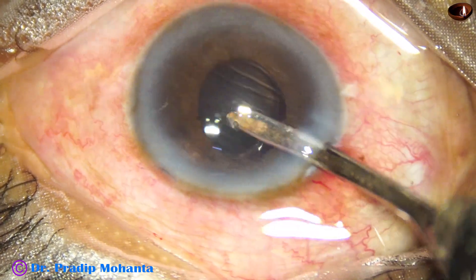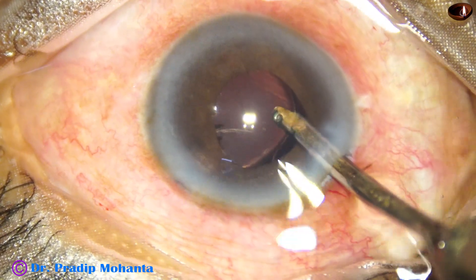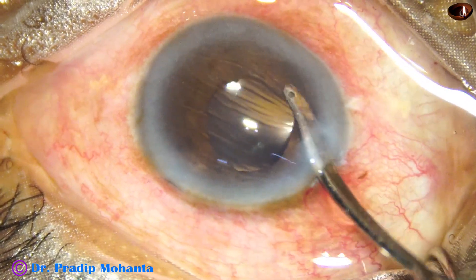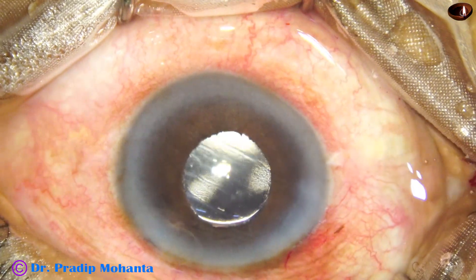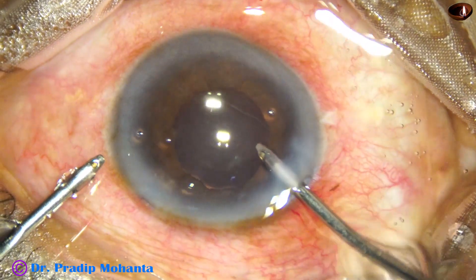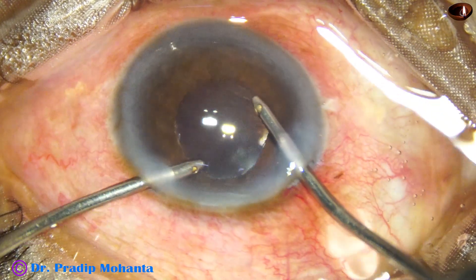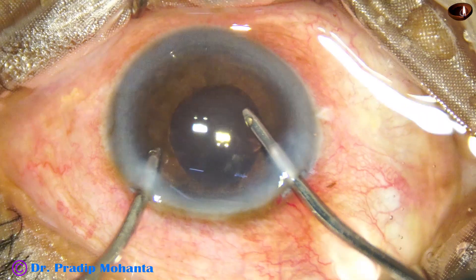Now is the time to clean the viscoelastic. I am using the 23G Simcoe cannula and have cleaned the visco partially both from the anterior chamber and from the capsular bag. Then I take the bimanual irrigation-aspiration — irrigation through the main wound — and do irrigation and aspiration together so all the viscoelastic in the anterior chamber comes out.